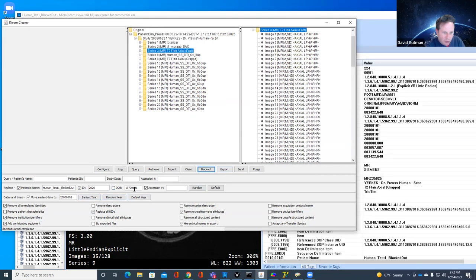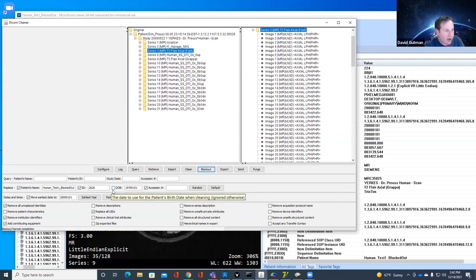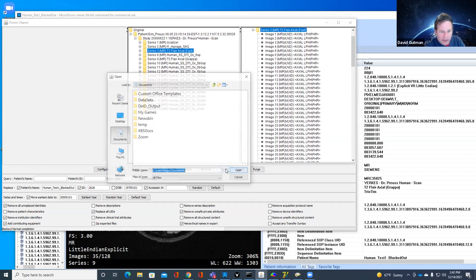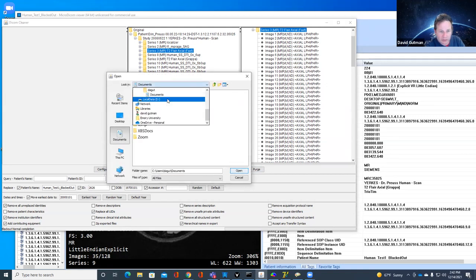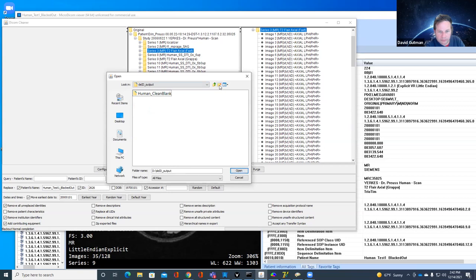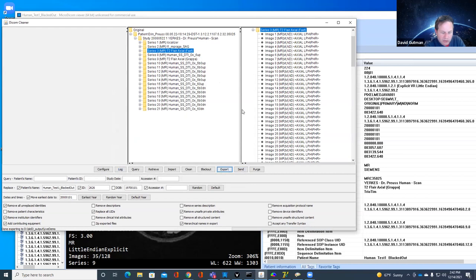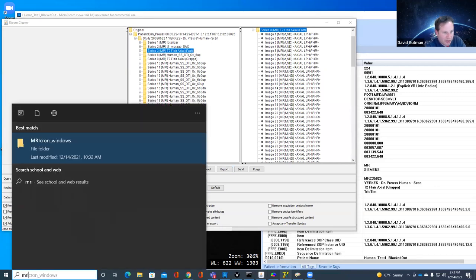The tool will also do time shifting or date replacement. I had accidentally unchecked the date of birth box because I've rebooted my computer several times today thanks to Zoom. So let's see what happens. Now I'm going to export this data — and I'll load it into a separate DICOM viewing tool just so I don't get confused about before and after.